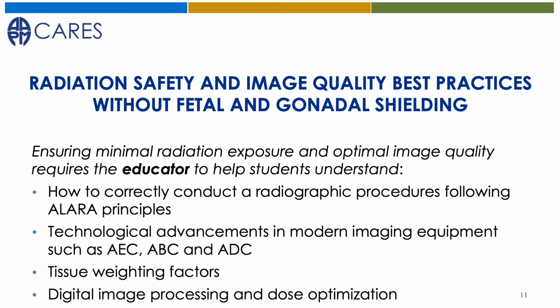Helping students understand the most current tissue weighting factors will also allow them to discern that the use of gonadal shielding during pelvic and abdominal radiography actually results in higher exposure to much more sensitive organs such as the intestines and the stomach. Lastly, we must ensure graduates understand digital imaging equipment and concepts such as deviation or exposure indices and dose creep in an effort to ensure optimizing patient dose.